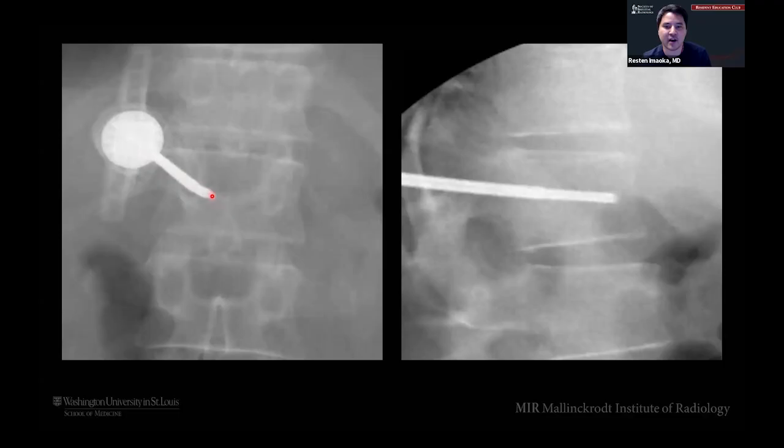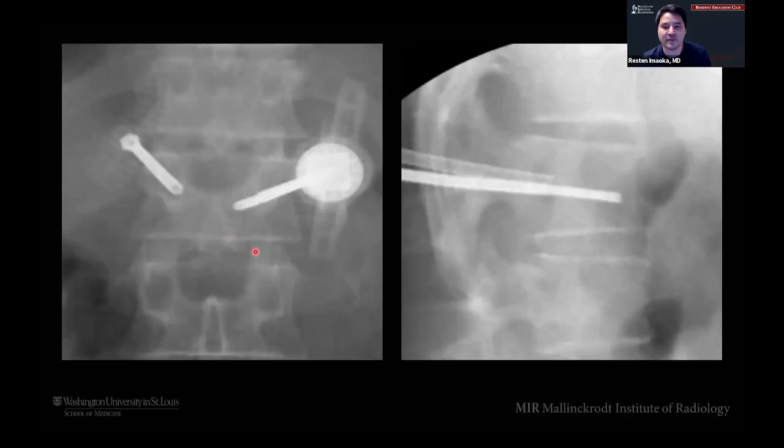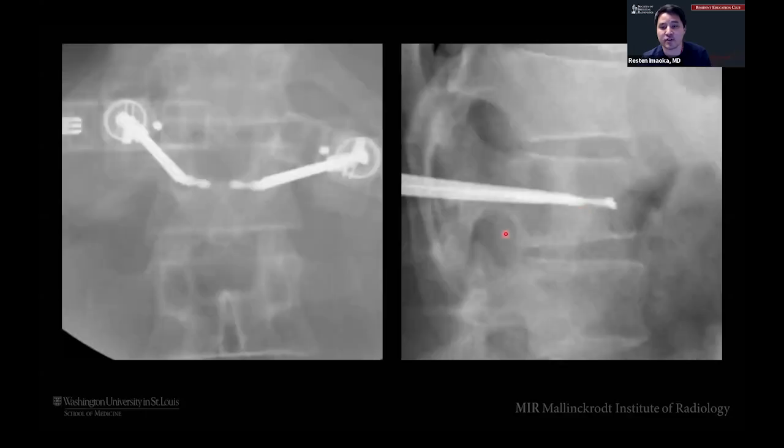And so you kind of get down and then you get your osteotomes that you're just about a spinous process distance apart. So this is the right side, the left side, and here on the right side, you can see we're stopping at the same thing here with our osteotome, and then eventually we're putting our probes in, right? So again, we always do this in a bipedicular fashion because we're trying to kill the entire vertebral body, just in case there's disease that we cannot appreciate on your PET or MRI.